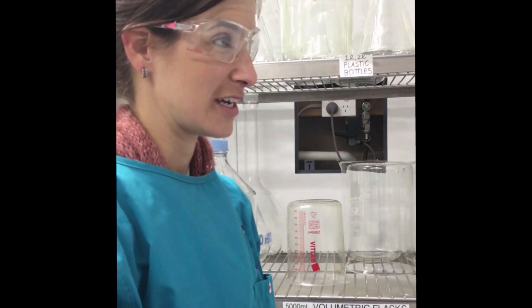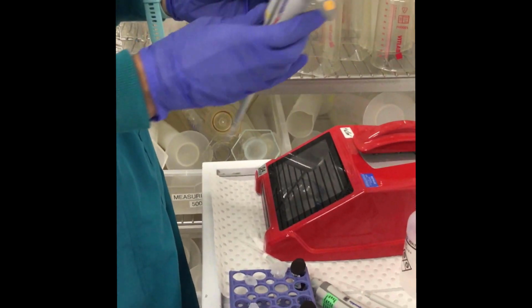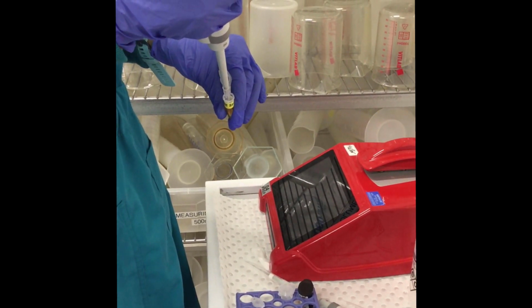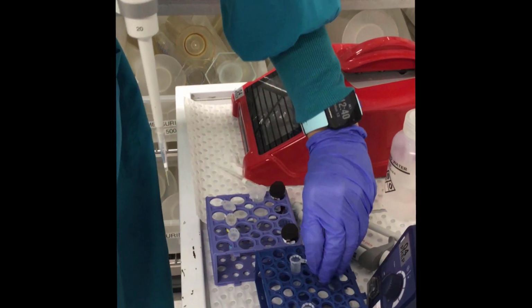We're first going to conduct a deproteination step using the Somogyi method. We're going to grab 20 microlitres of our test serum, and place it in a 2 ml tube.